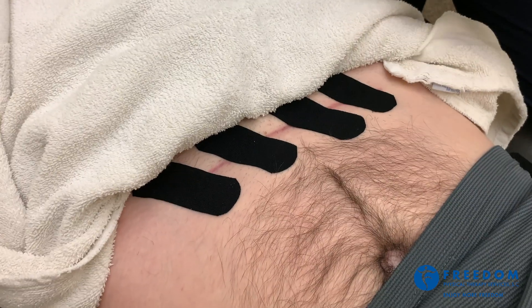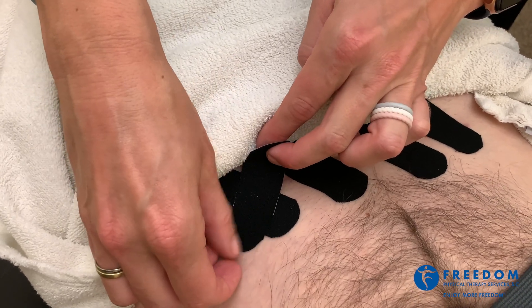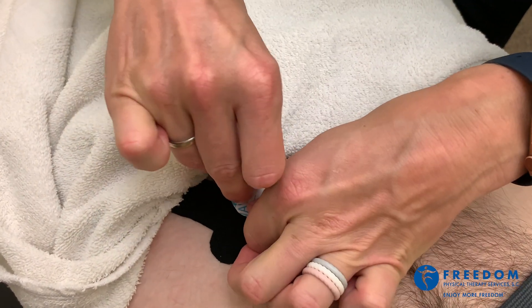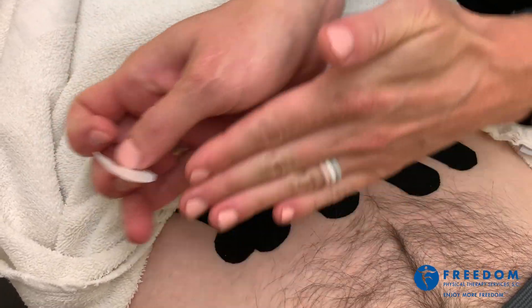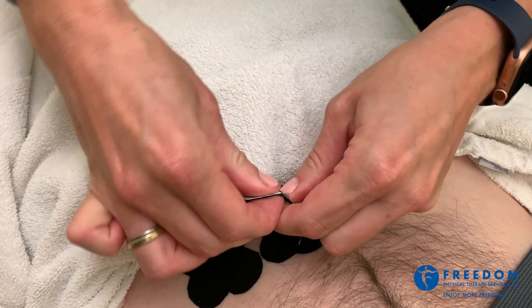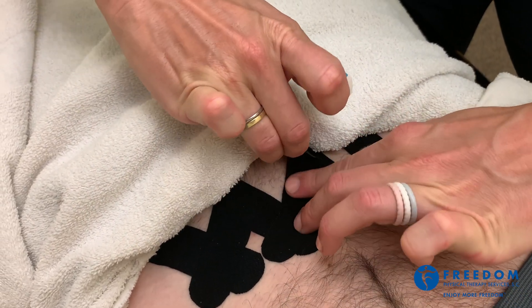The second phase of this is coming across in the other direction. You want to make sure that the tape is on the skin on the ends because it doesn't stick very well to itself. Come down and across in the opposite direction so that we have the tape pulling in opposite directions with movement. Cover the entirety of the scar if possible.